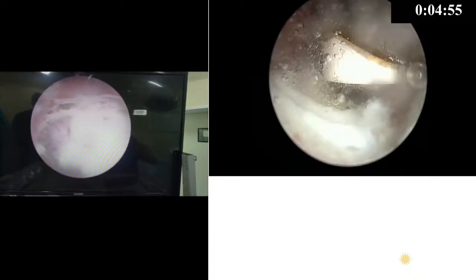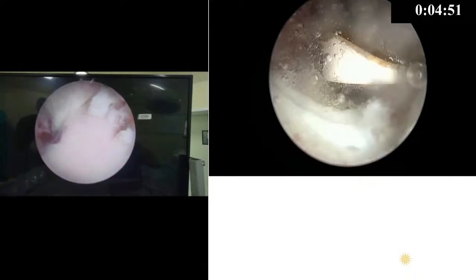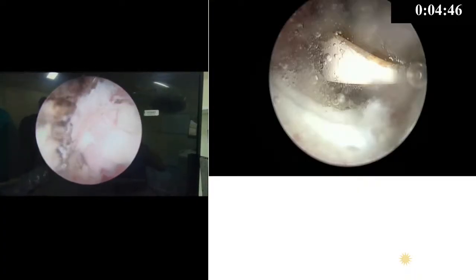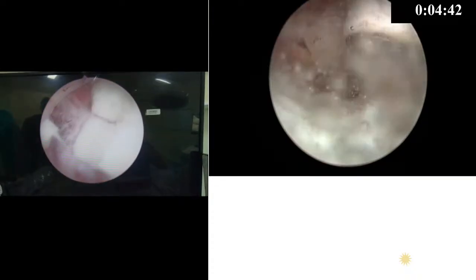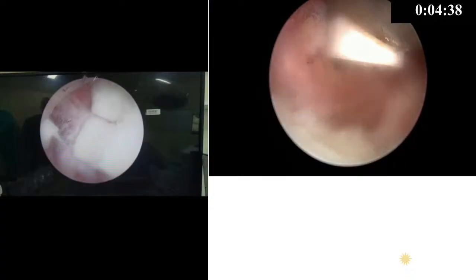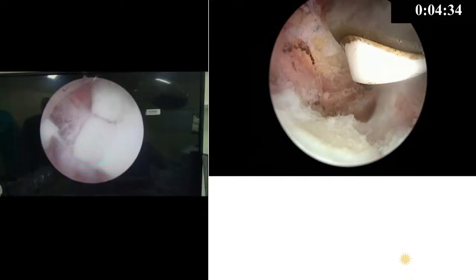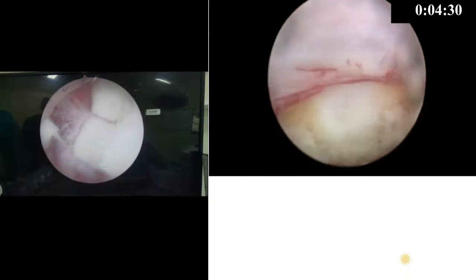Now, this is one of the surgeries where there was an acute disc herniation. If you look at this, this is an acute disc herniation and gives you the best results. Docking again under lateral fluoroscopy. This is the scope confirmation. This is a laminoforaminotomy that has been performed. We've kept a lot of flavum intact, and if you see that over here a pediculotomy has been done, I'll show it in this one. A pediculotomy has been done and the disc has been removed.